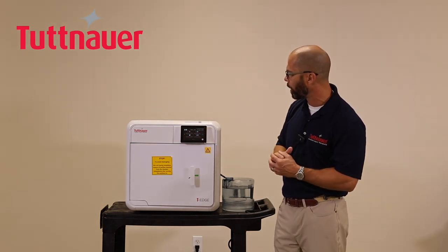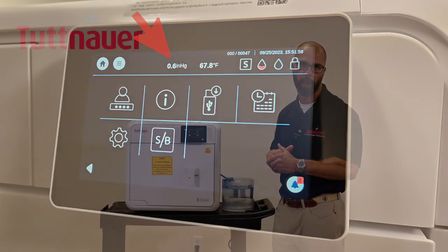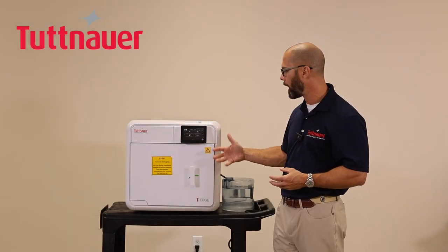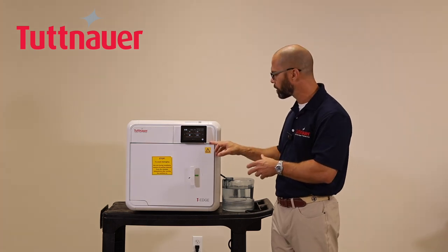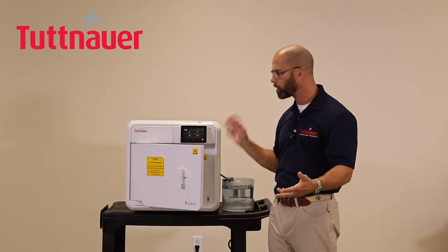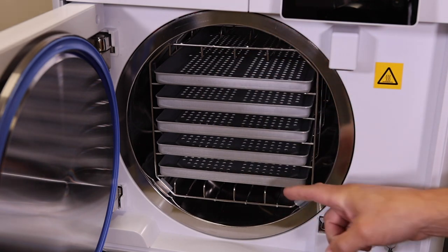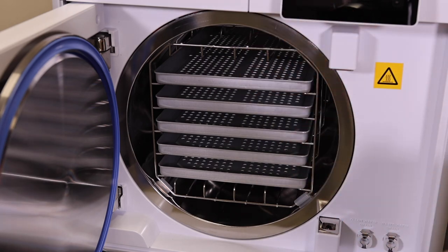Along the top status bar you'll see PSIG — the chamber pressure — which you don't need to worry about much. You'll also see the chamber temperature, and you'll notice it begins heating up as soon as the machine is turned on. Make sure the chamber is empty of any residual packaging material or contents from a prior cycle. You'll notice small rubber bumpers inside — leave these on, as they minimize scratching of the tray holder and can handle sterilization heat.